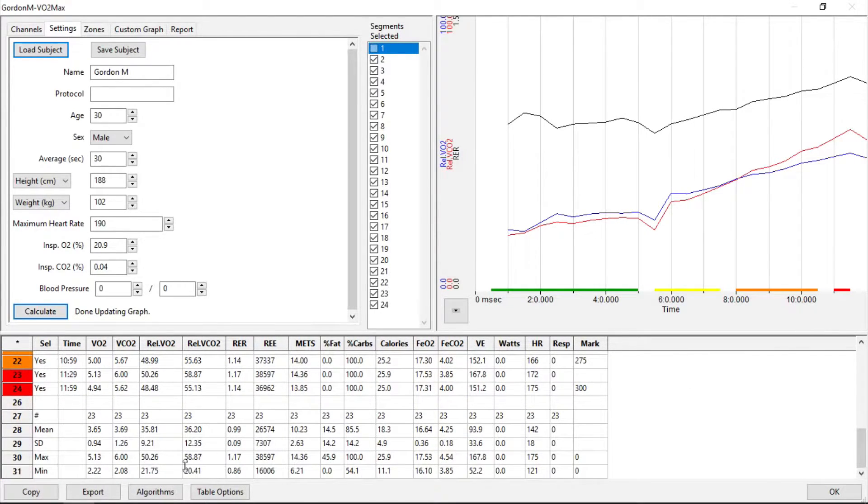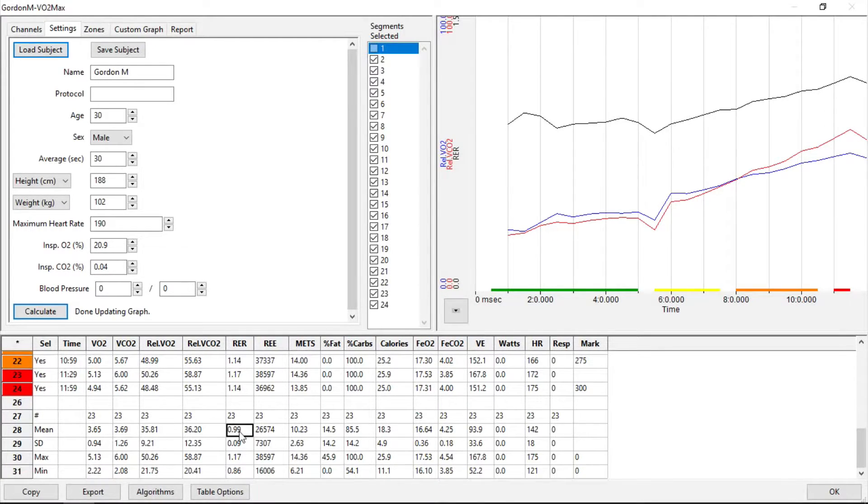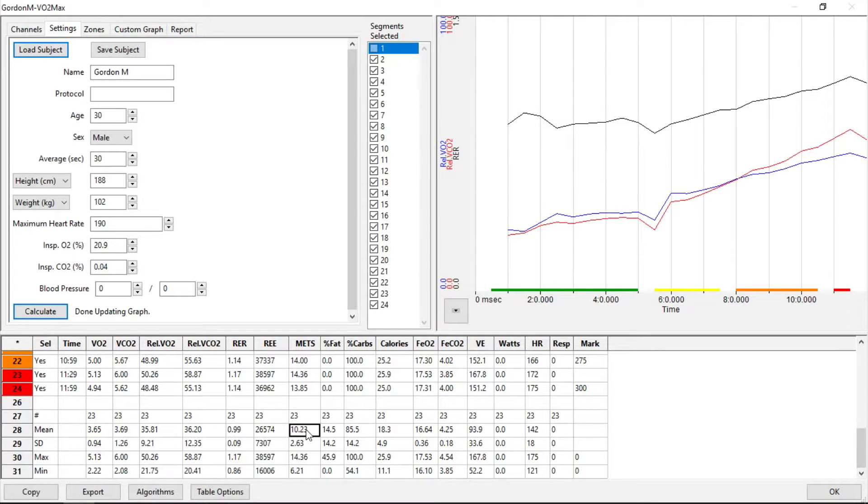Going to the bottom here, here's our Max VO2, here's our RER, and here's our METS calculation.